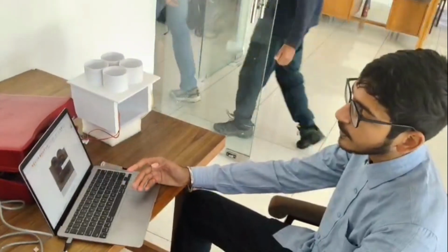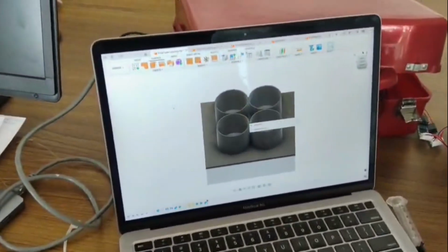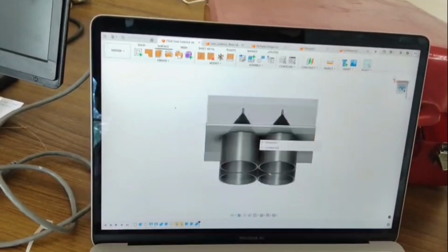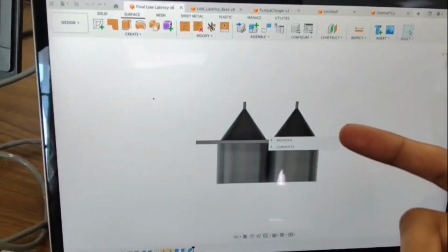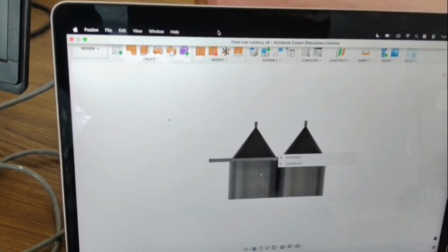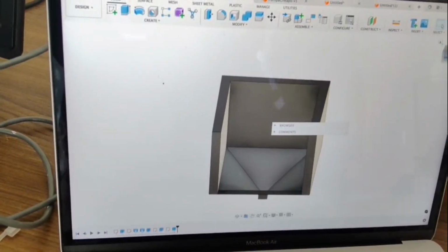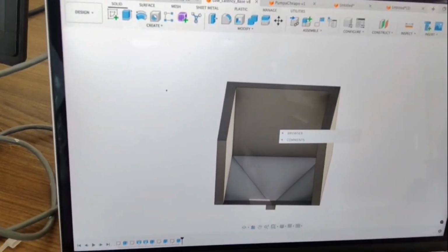As discussed earlier, this is a 3D hopper model, a medical model, which has 4 cylindrical containers. Each stores medicine, and below these you can see there are four conical structures which are used for dispensing the liquid, and this whole hopper model is placed on a housing structure. This structure has enough area and dimension for the placement of the hopper model and has an inclination on the floor which increases the efficiency of our dispensing.